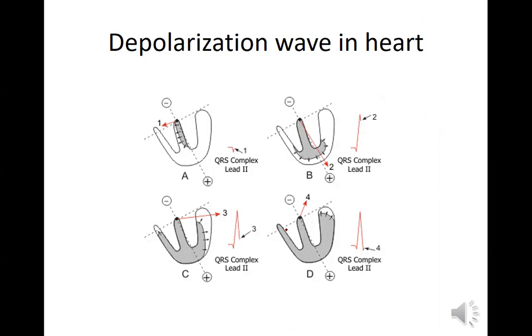Because especially in the chest leads, if you're laughing, or you're hiccuping, or you're talking, breathing heavy, then you're going to be depolarizing everything. So yeah, the artifact should be in every lead, technically.